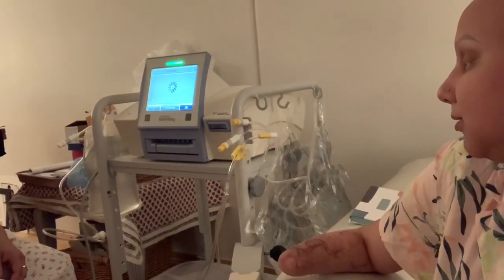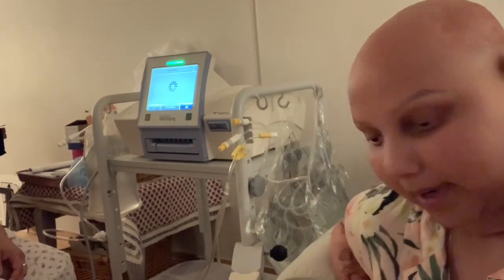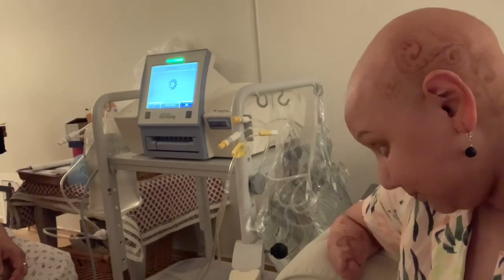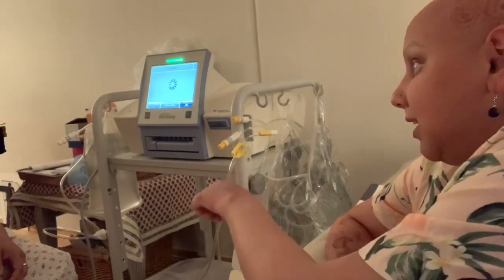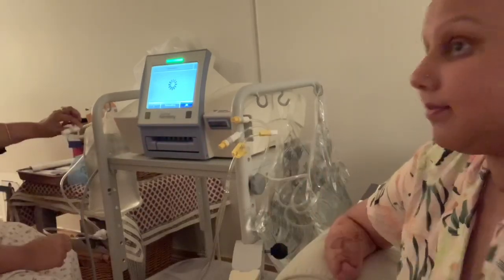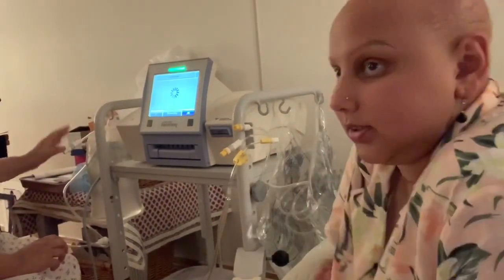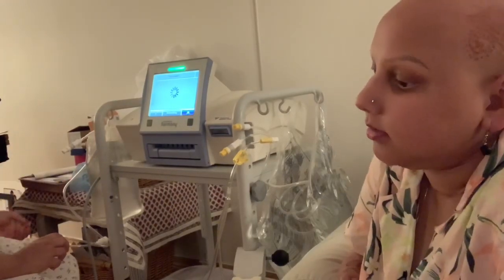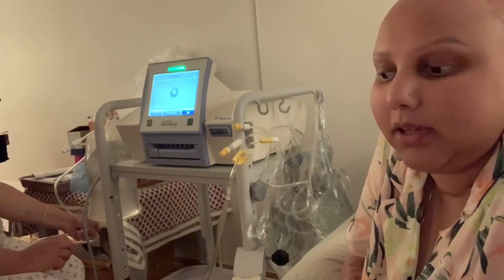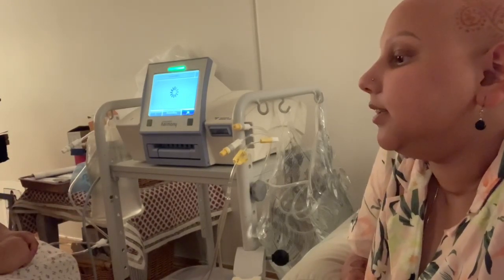We're waiting for the machine to prepare itself — a tray will come out and all these wires have to be hooked to it. The ones with barcodes on them: the machine reads the barcodes and identifies which type of fluids they are. If it sees something is wrong, it will recognize it and give an alert.